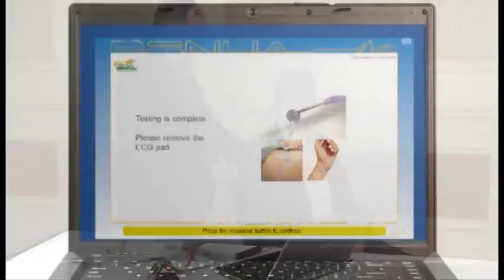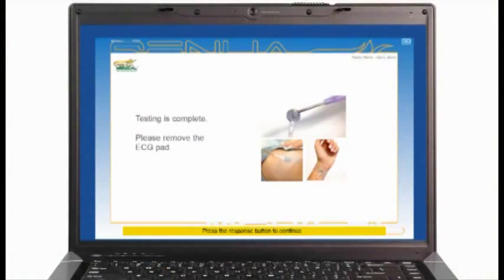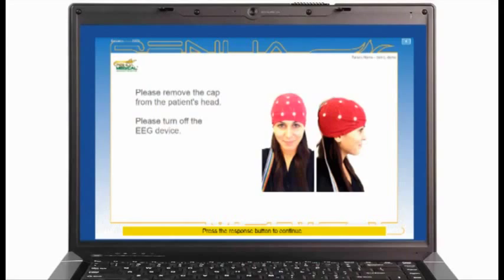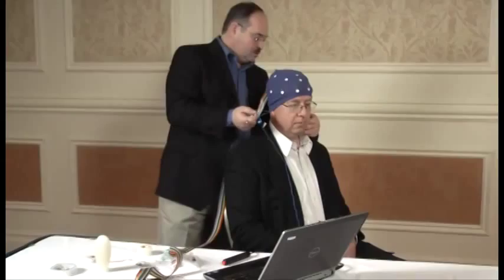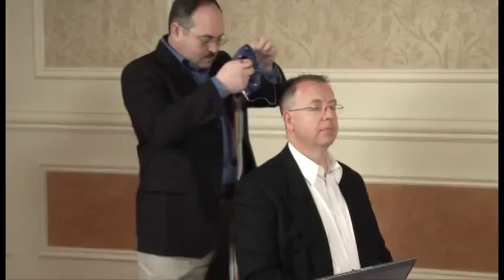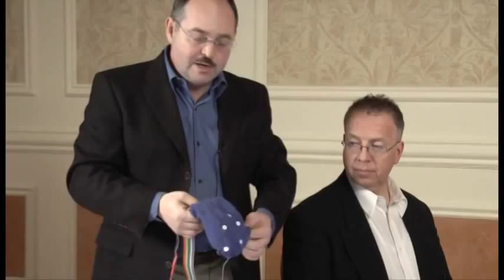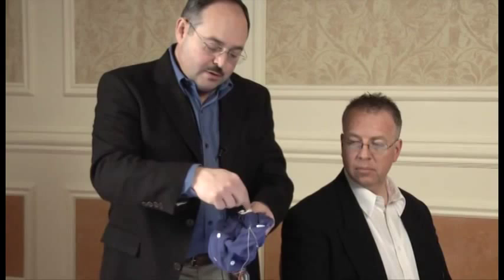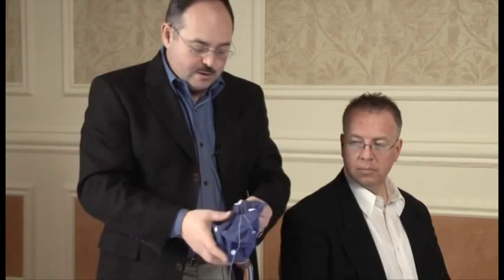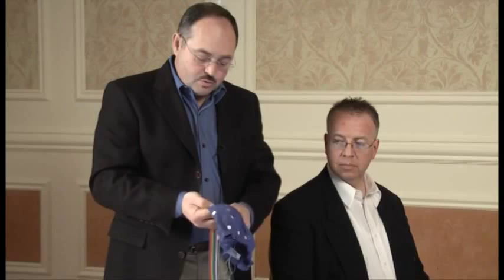Good, you're done. The instructions show now how to take everything off just like it was put on. Take the ear clips off, take the patch off, earbuds and the cap. It's important that you wash the cap in between uses and let it dry thoroughly. The way you wash the cap: run it under water cleaning the hole with the wooden instrument that comes in the kit. Periodically use ivory soap, no other type of soap, to wash the cap entirely. These are standard FDA approved cleaning measures.